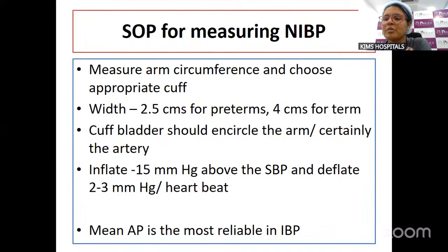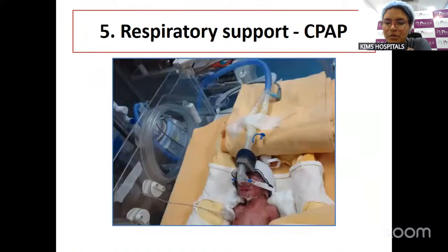So invasive blood pressure monitoring uses a pressure transducer that directly measures the pressure, whereas non-invasive blood pressure monitoring is based on oscillometry.